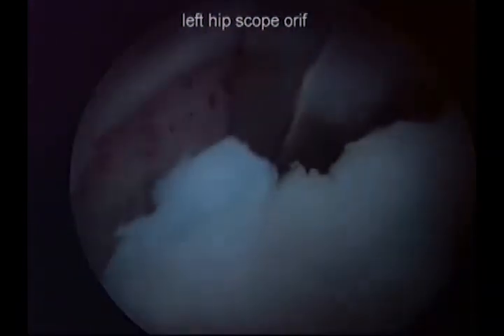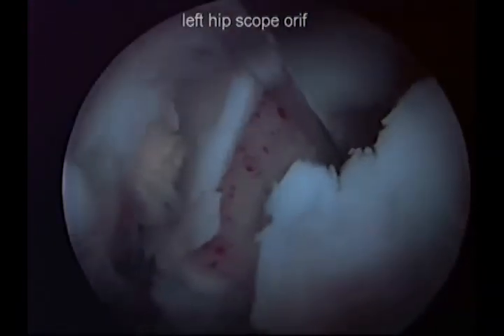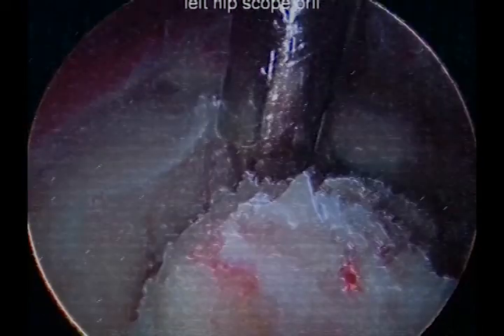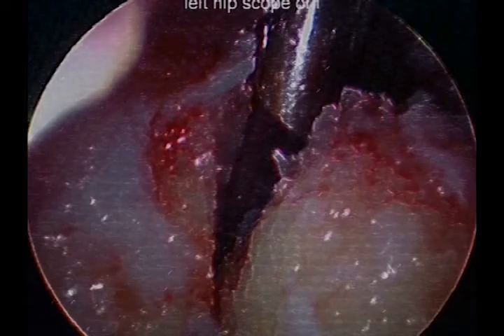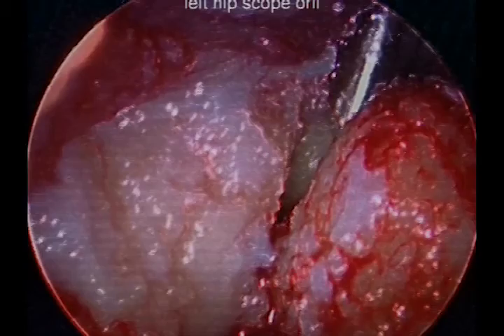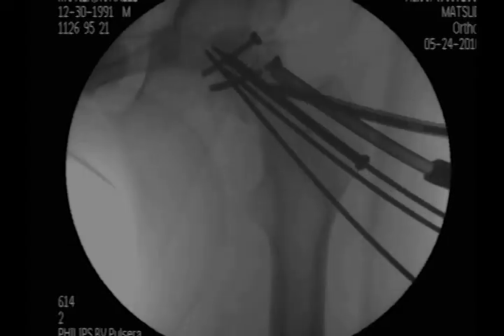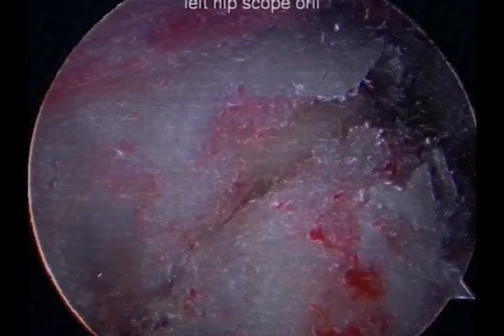Once the fragment was reduced in an acceptable position by arthroscopic and fluoroscopic guidance, we then inserted bone graft putty into the malunion fracture site via arthroscopic cannula, using the stylet to push the putty into the malunion fracture site.